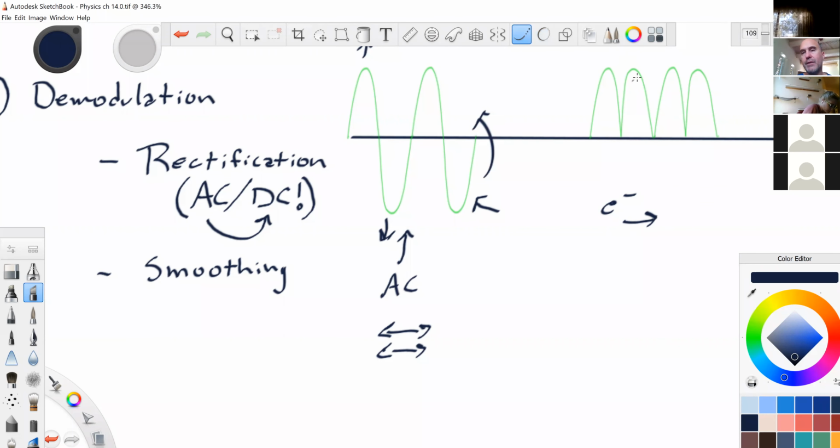So you have all these voltages above our baseline, but it just means that they're going in one direction, and it's like fast pulses, and the machine doesn't necessarily want that. So then it smooths them out to create one smooth, easy to manipulate, easy to use voltage blip of voltage.